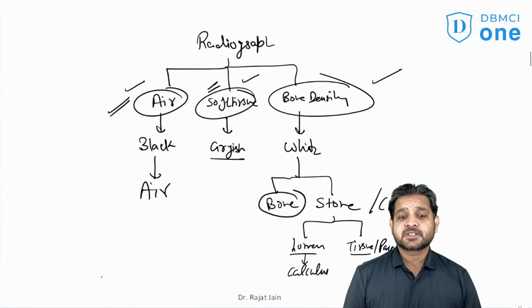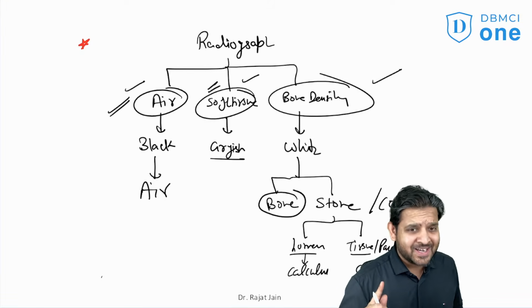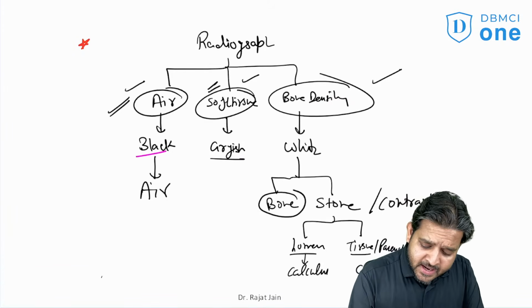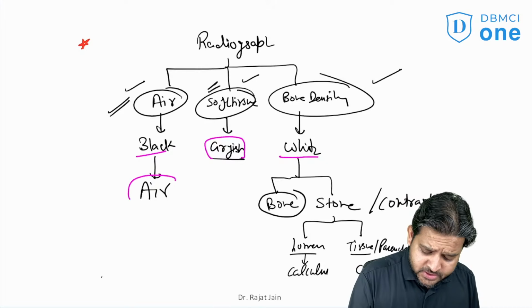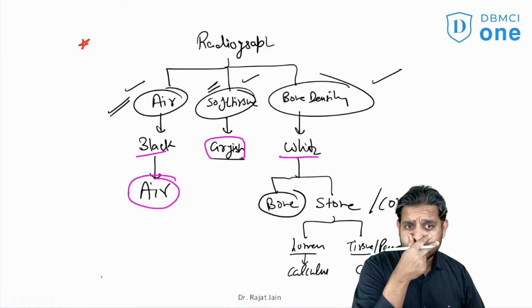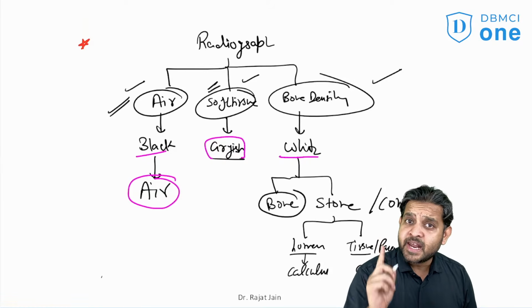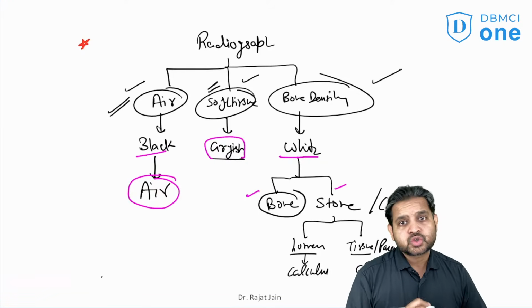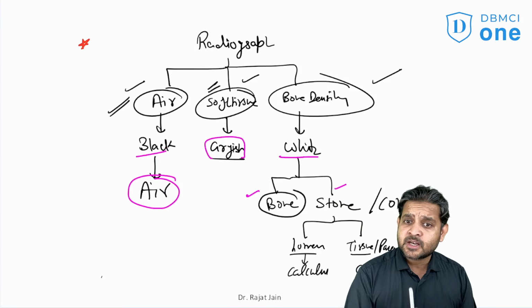So now let us see this. This is the basic concept of imaging that I want you to remember, and we will quickly revise it. If you see a radiograph, please remember you will see 3 colors. Either it is black, or it is grayish, or it is whitish. If it is black, it has to be air. There cannot be anything other than air which is black. Now if it is white, and it's a plain X-ray, a non-contrast X-ray, it is either bone or stone.